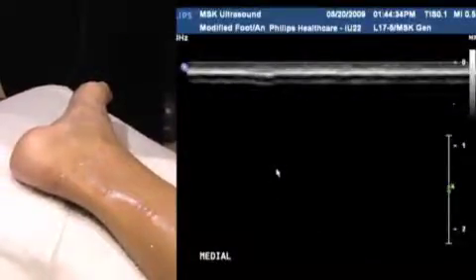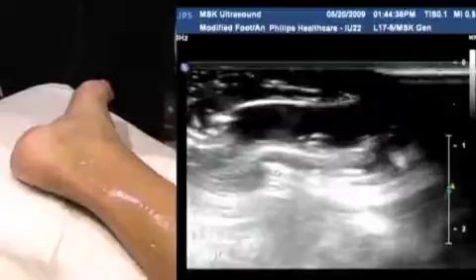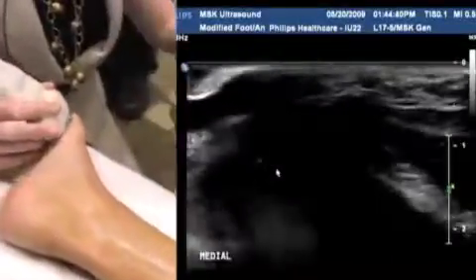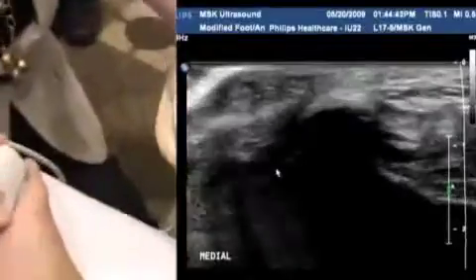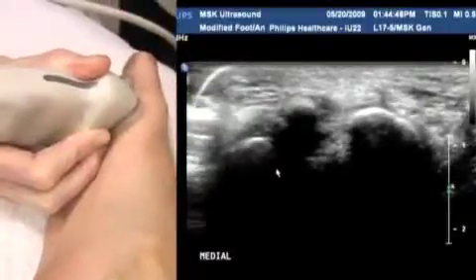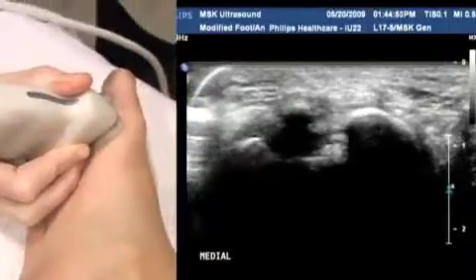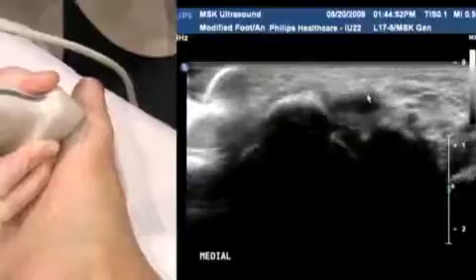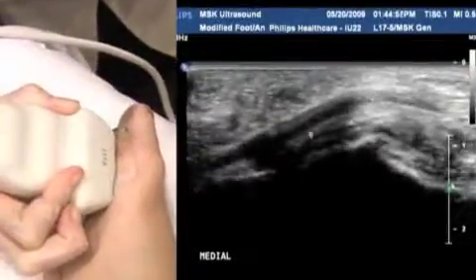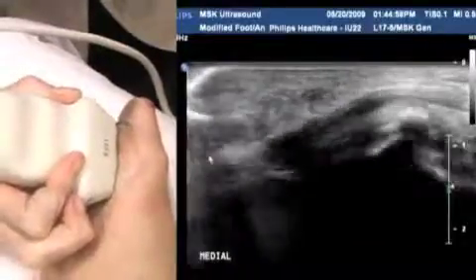There's the flexor hallucis longus, as the name suggests. Flexors the big toe. So you need to come all the way down now to the big toe. You can see flexor hallucis here, above the sesamoid, all the way down, and attaching onto the big toe distally.